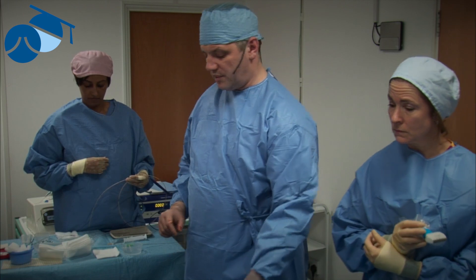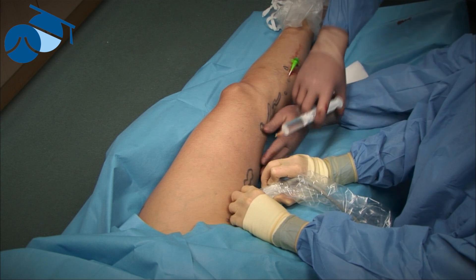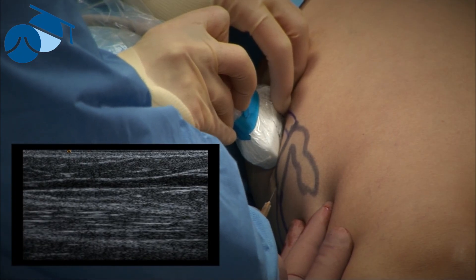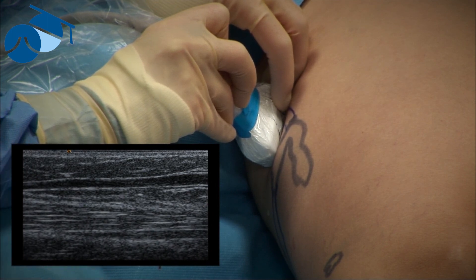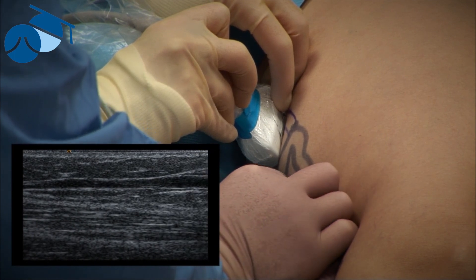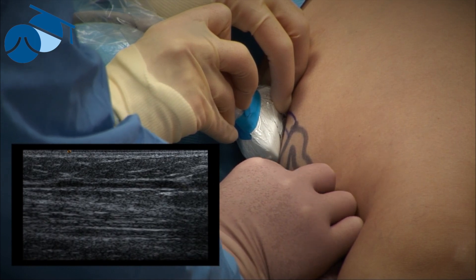We find the entry point at the other end. We apply a little local anesthetic just into the skin here to numb that area. Then, exactly the same again, we're going to use the micropuncture needle to gain access into that vein. We pop it through the skin first, then wiggle side to side to find the maximum signal strength. Once we see that, we can dive straight down into the vein itself.